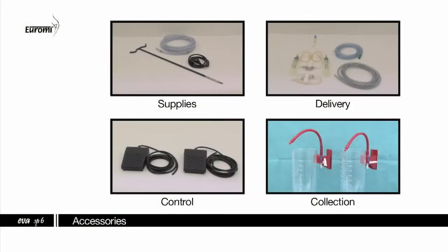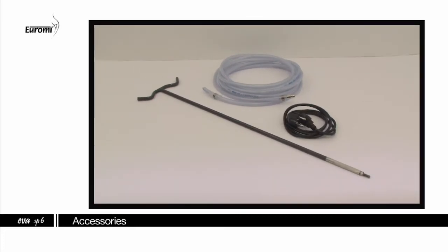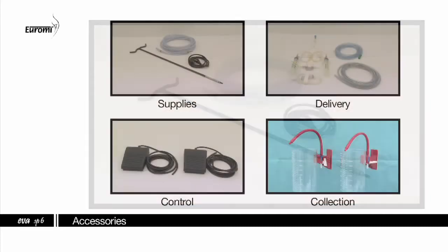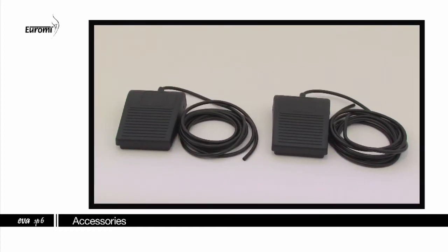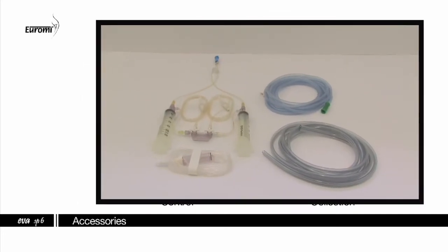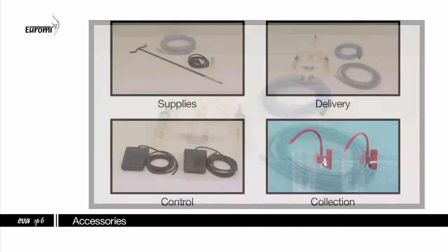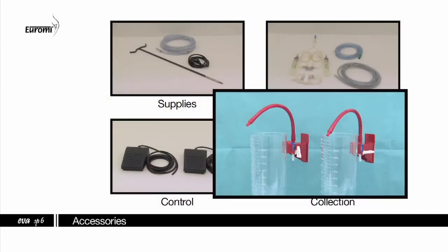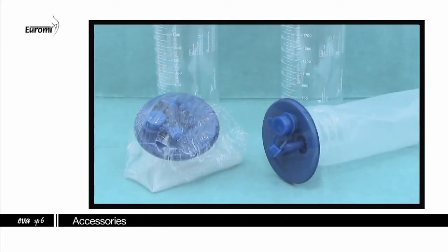Accessories are classified in 4 categories. The category supplies includes a power cable, an air source cable, an infusion stand. The category control includes 2 pedals. The category delivery includes air tubing, fat tubing, perfusion line, infiltration tubing. The category collection includes 2 jars for fat collection, 2 canisters for fat collection.